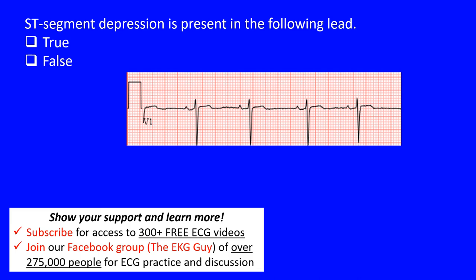Here we have a true or false question, and it states the ST segment depression is present in the following lead. We have lead V1 here, and remember this is a right precordial lead. We're asking: is ST segment depression present or not?